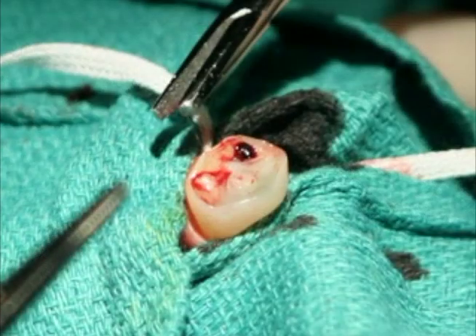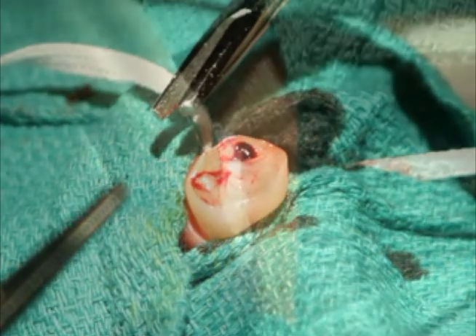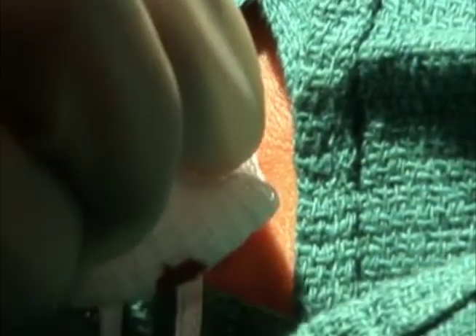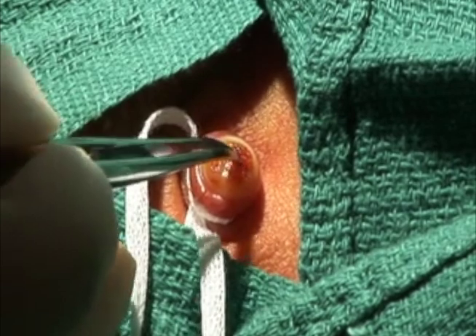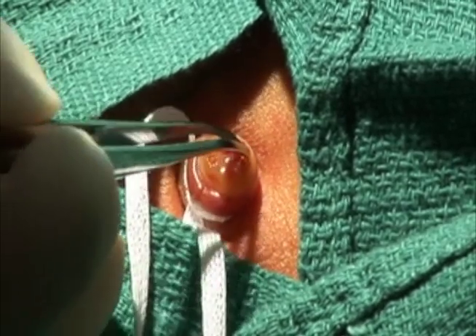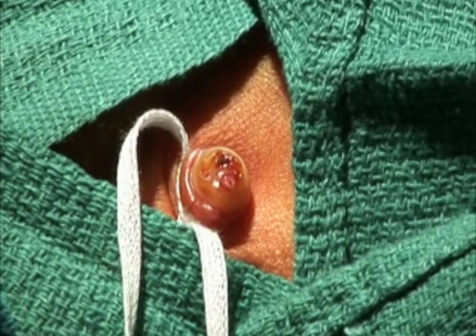Ask the assistant to remove the cut cord and clamp from the field. Identify vessels within the cord. Control any bleeding by adjusting tension on the umbilical tie and by blotting, not rubbing, the freshly cut surface. It is feasible for a single operator to place an umbilical catheter successfully. However, we will describe and demonstrate the procedure for the operator working with an assistant donning sterile attire.